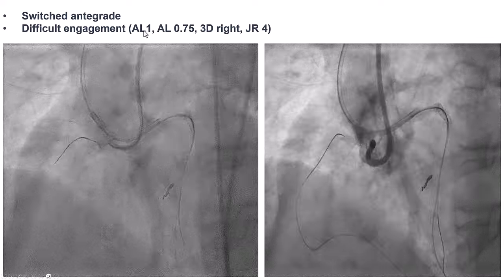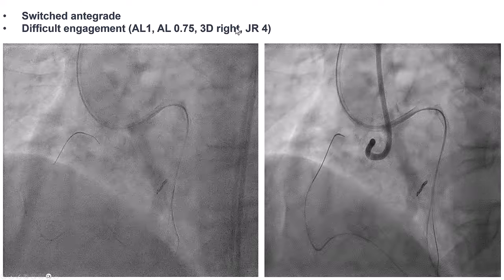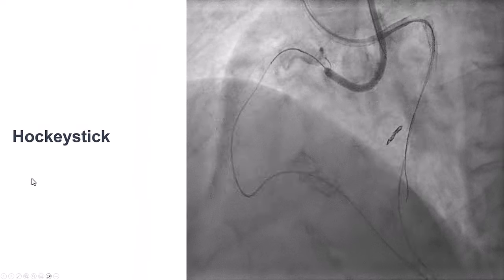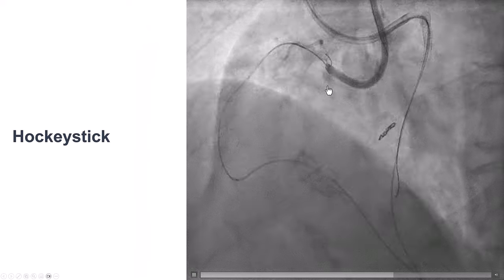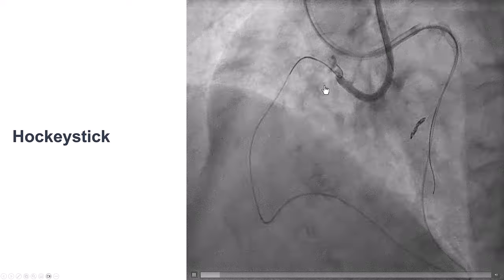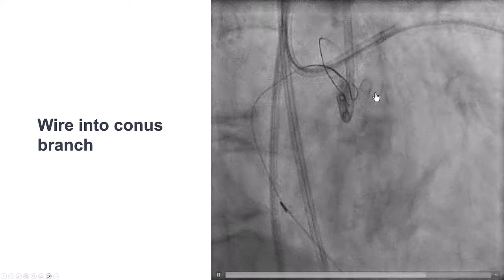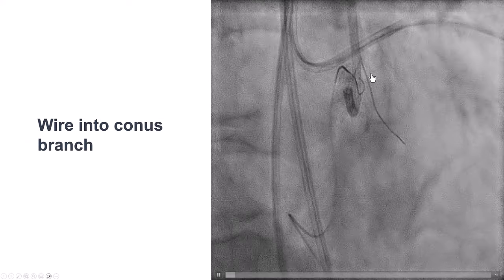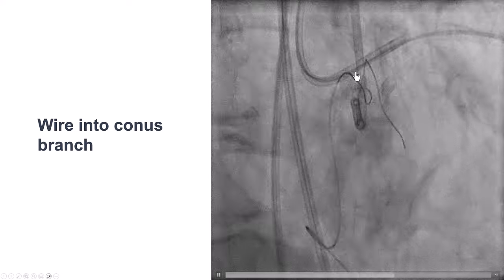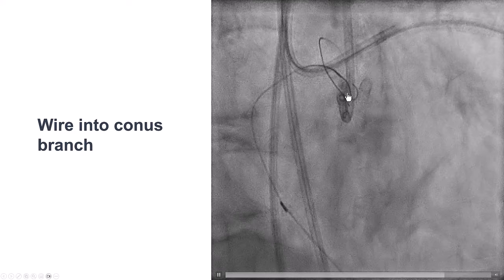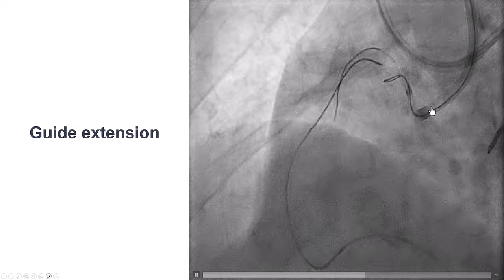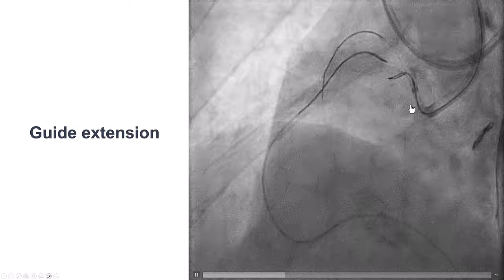We tried several guides — AL1, AL0.75, 3D Right, JR4 — with a lot of difficulty. Eventually, the Hockey Stick (an 8 French Hockey Stick guide) seemed to engage better and provide a little better support. We were also able to advance a guide wire into the conus branch originating proximal to the proximal cap, which was very useful for helping stabilize our guide catheter in the proximal RCA.